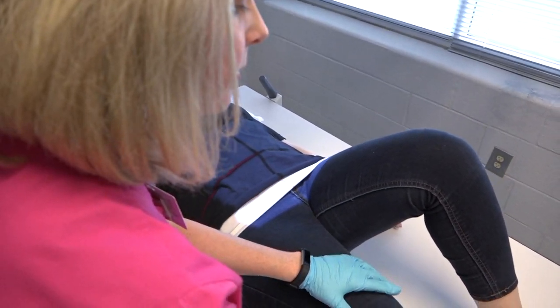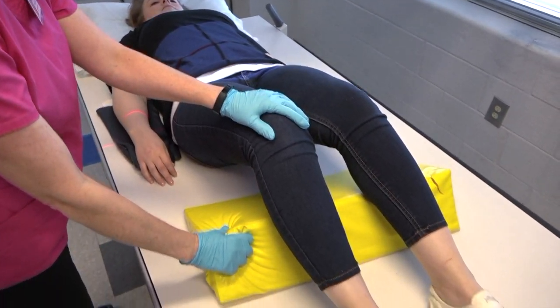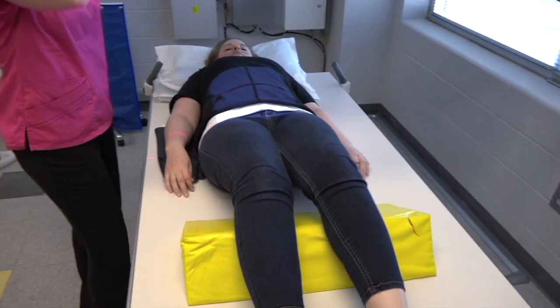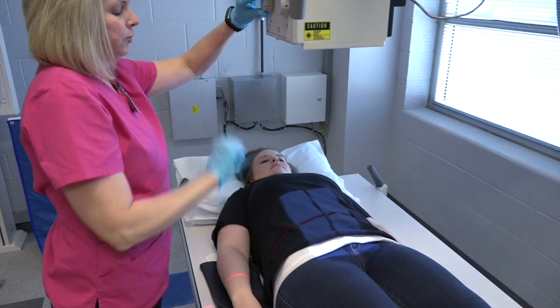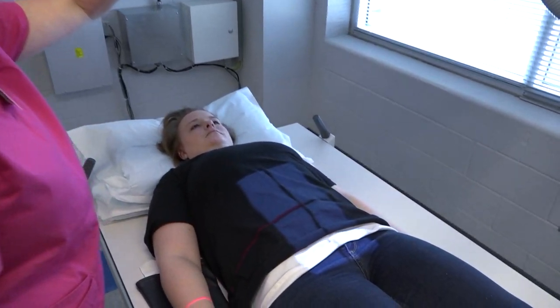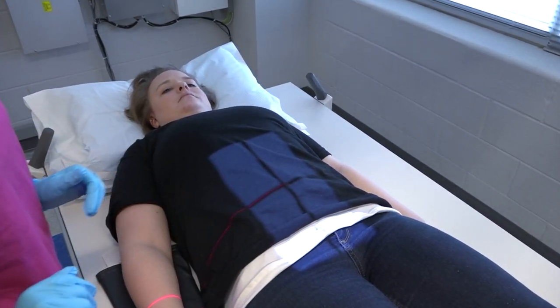Stretch them out just a little bit. There we go. You can even put a sponge under their legs. There you go. That'll help you see your anatomy a little bit better. So our CR is at the crest. We're going to collimate in. We want to make sure we include T12 through S1 in the AP.